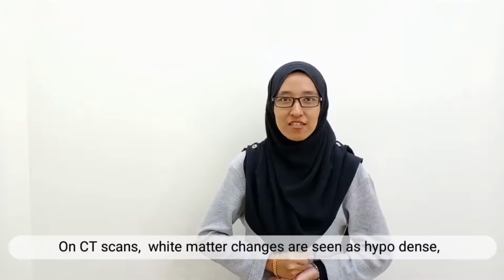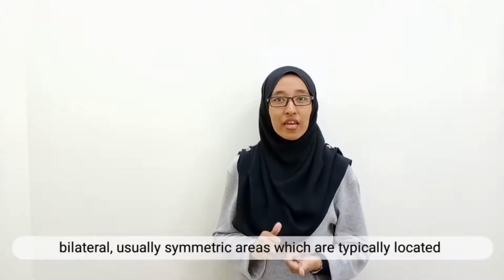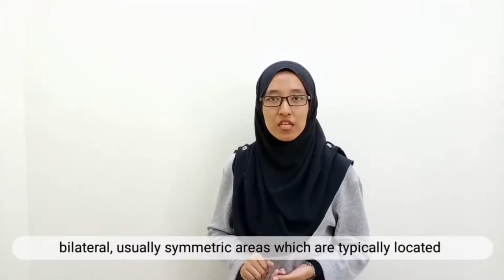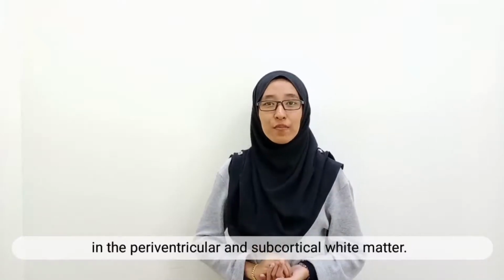On CT scans, white matter changes are seen as hypodense bilateral, usually symmetric areas, which are typically located in the periventricular and subcortical white matter.